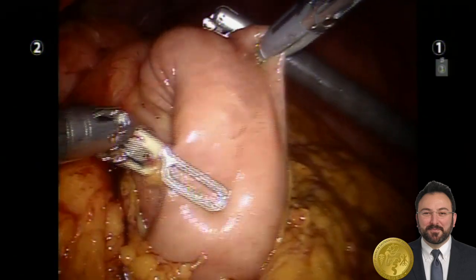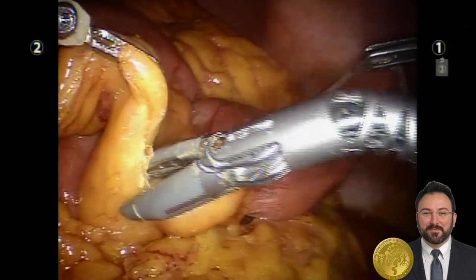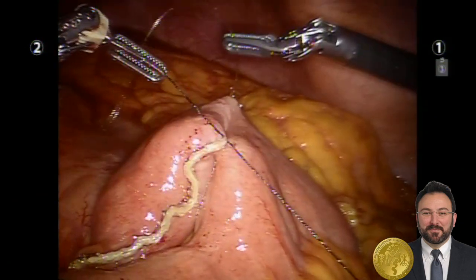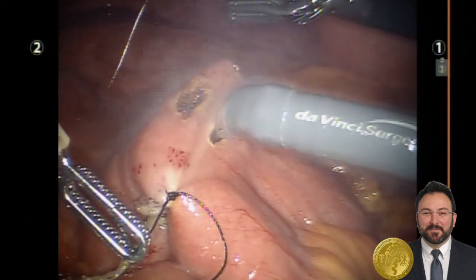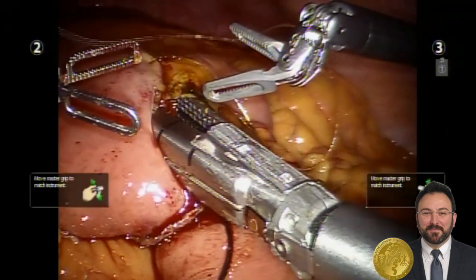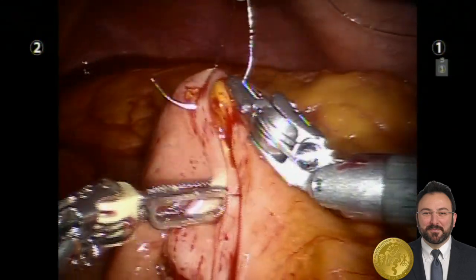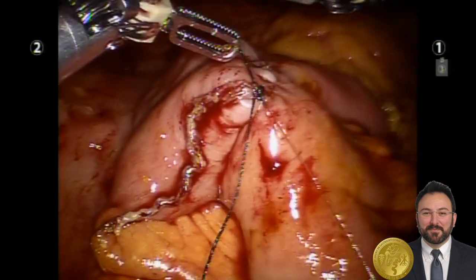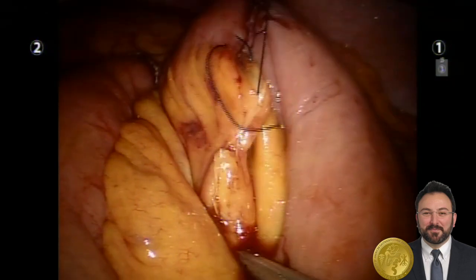A retrocolic Roux-en-Y approach was adopted. The jejunojejunal anastomosis is being fashioned using a linear stapler and a spiral knotless absorbable suture. The anterior enterotomy was closed with a running suture, and the defect in the mesentery was similarly closed with a running suture.